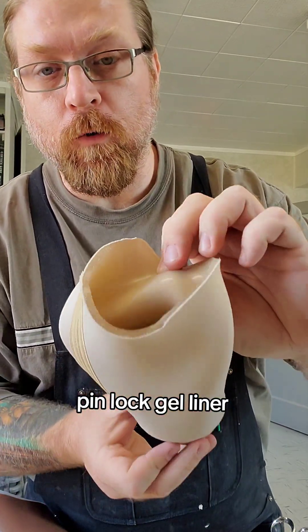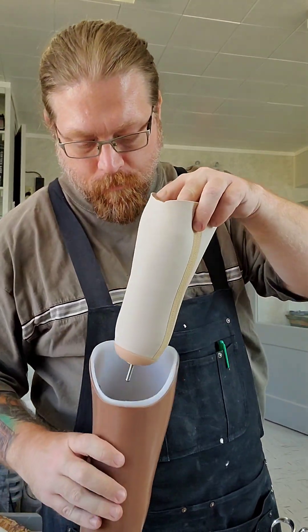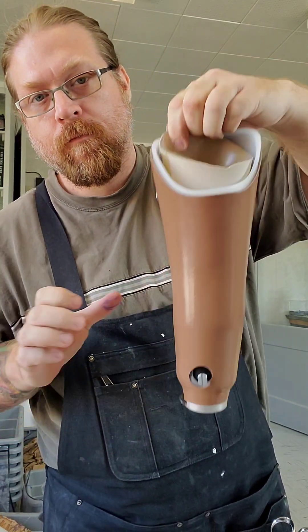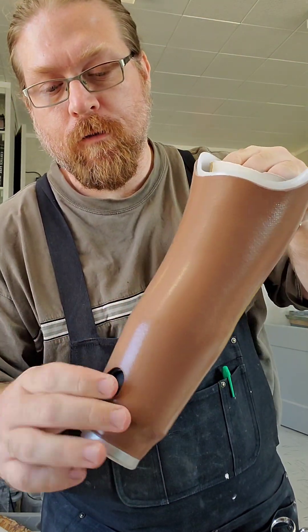The gel liner will roll up onto the arm — it has a little pin lock. It really holds it on there. If you want to release, you can turn it off the arm and then release.